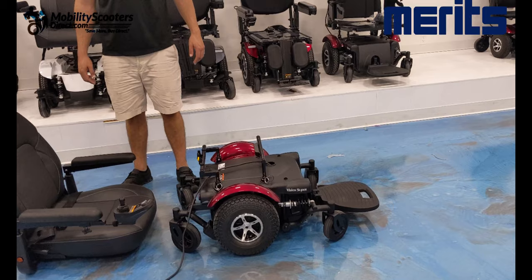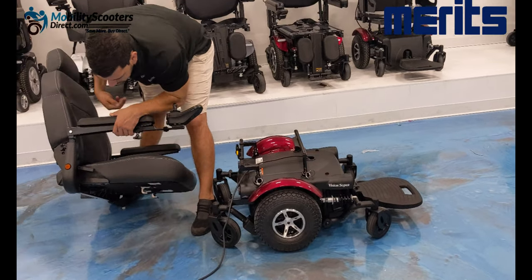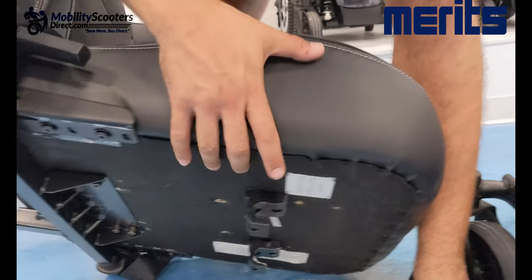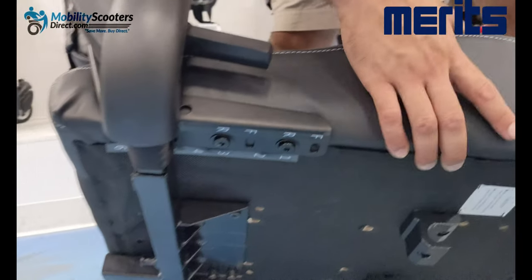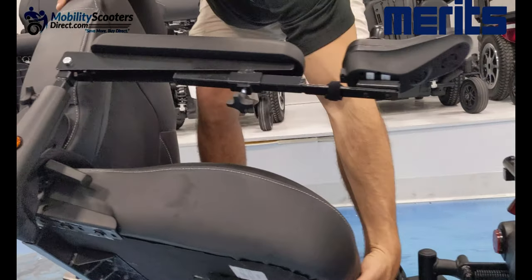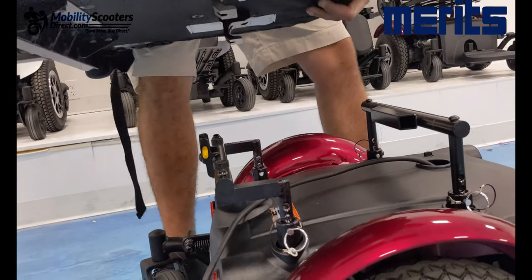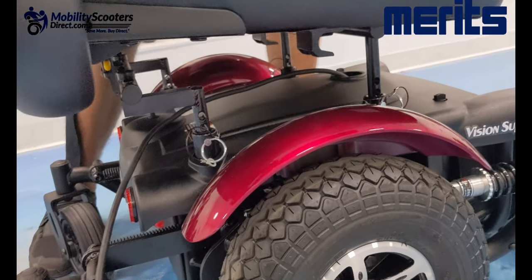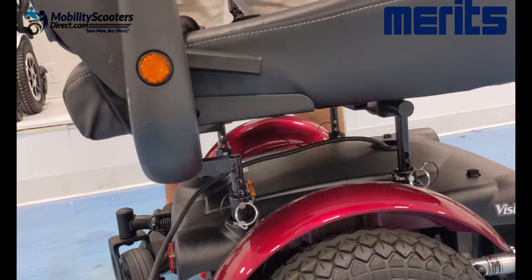To put the seat back on, identify the two hooks in the front and hook them into the front rail. Once hooked, drop the rear part into the clipping system — it will pretty much handle the job on its own. You'll just want to hear a little click to confirm it fell into place correctly. Hook the front two hooks into the bar, make sure they're lined up before sliding it forward — it might take a little wiggling, but once they're in you'll feel it. Having someone to help guide you is always better.